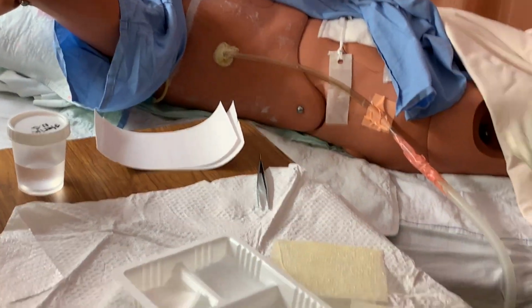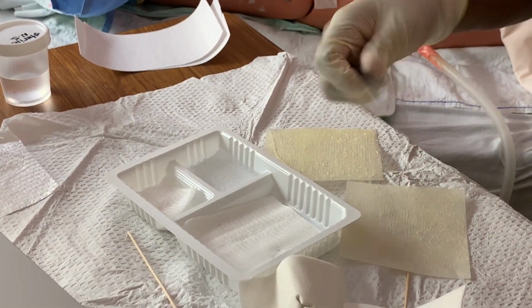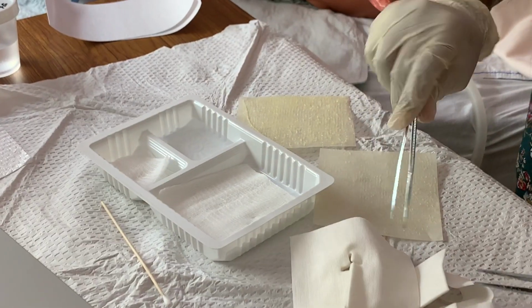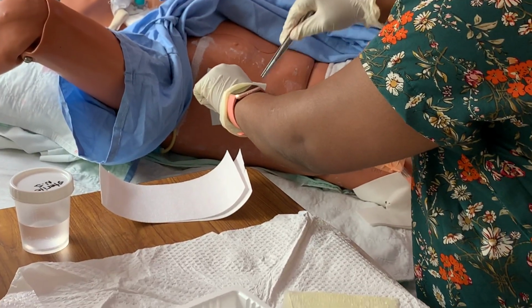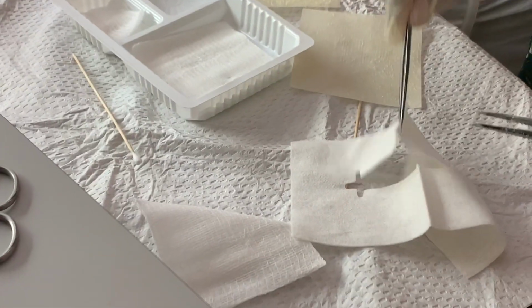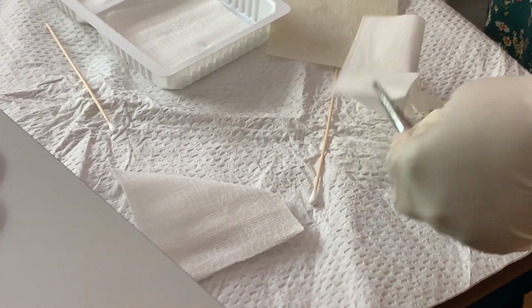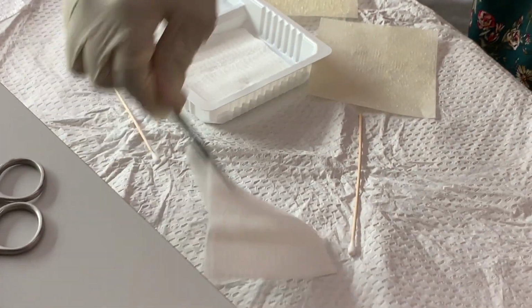So that I've put there. Now I'm just gonna put some drain sponges on it. Okay, so that's dirty. I'm gonna put it together. So I'm gonna put the gauze on top there.